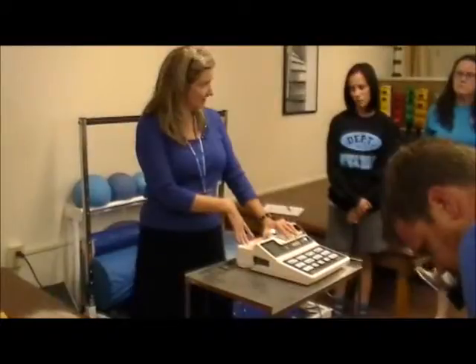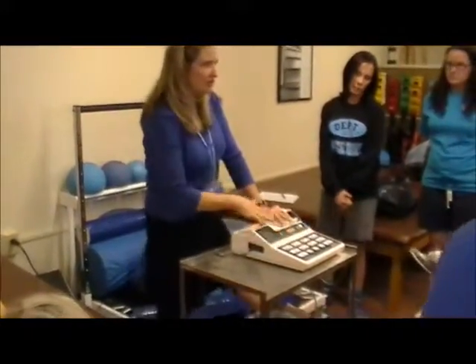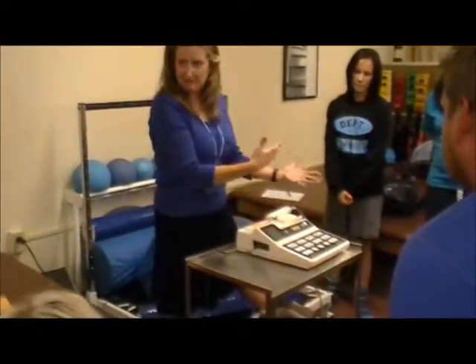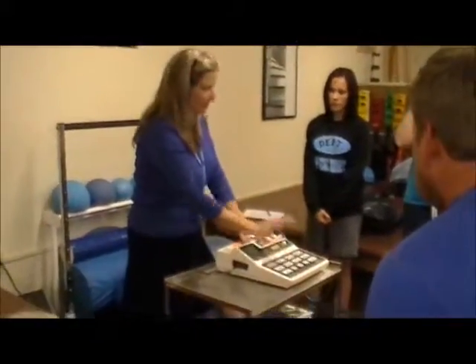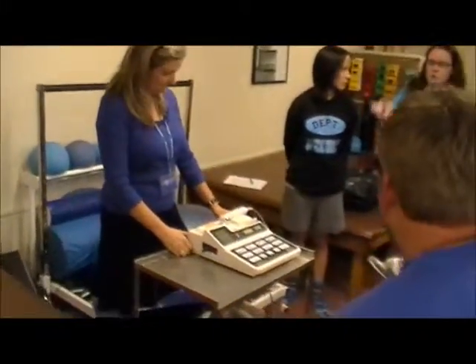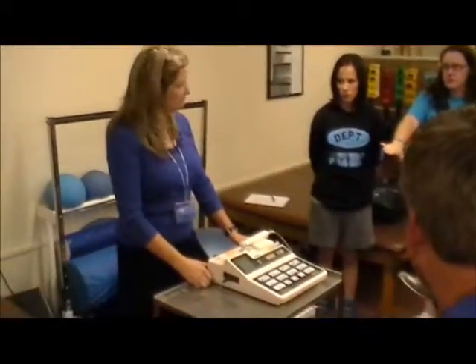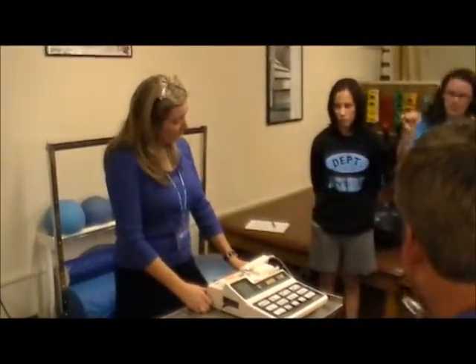Okay, questions? Same as before, if you hit pause, it'll keep what you have, and then when you hit start again, it goes back to it if they need to shift or whatever. If you need to stop, you've got the stop button, turn off back here. So on this one, if you were to go the full duration, it would turn off by itself like it did on ultrasound. But since we're not going the full duration, we just hit stop.